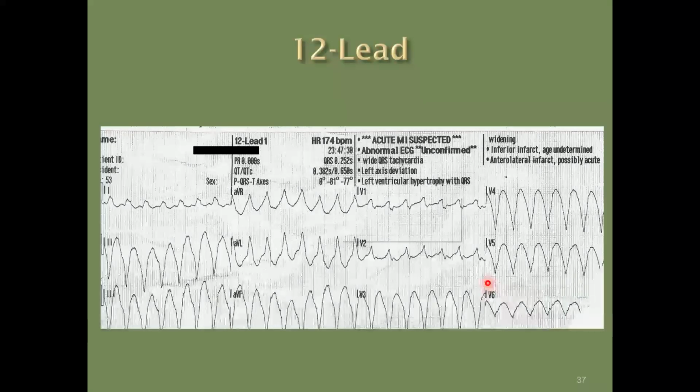Get the pads. Even if they're talking, put the pads on them. Now, I will caution. I've had this happen out in the community where somebody was having chest pain and they wanted to put the AED on. I was like, no, please don't, not yet. Because I don't want an AED to shock a patient. But in your case where you are in control, then yes.